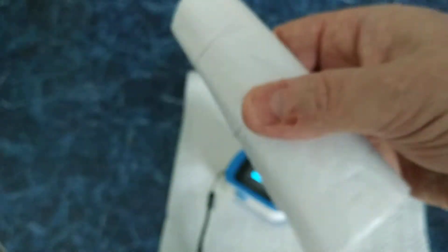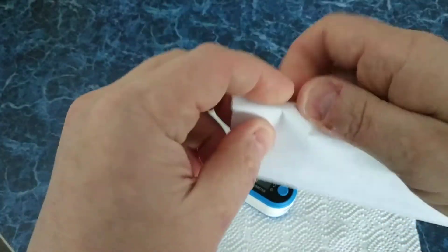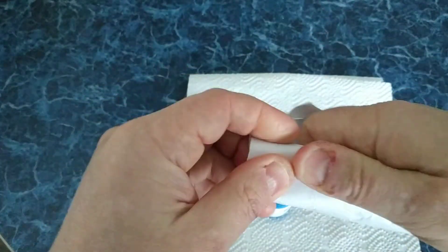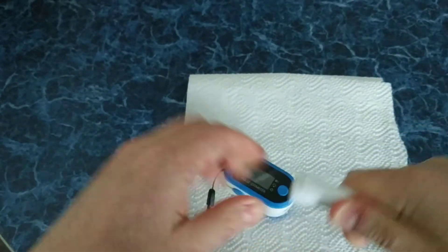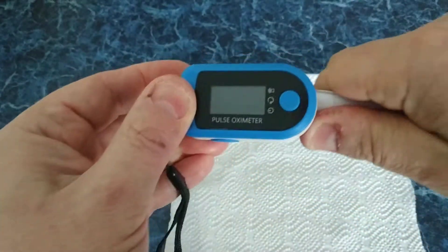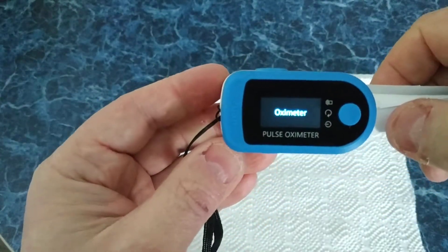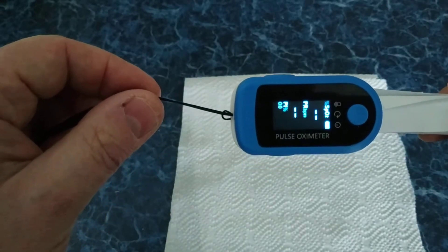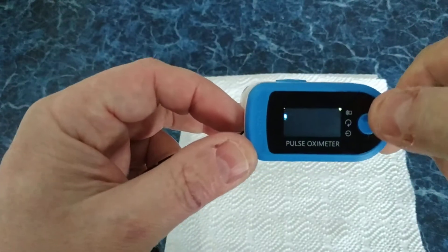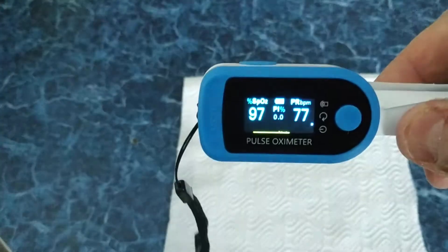Let's try something else. For example, a piece of paper. Just roll it and put it inside. Press this button. What do we have? Wow. It's the same — oxygen level is 97%.